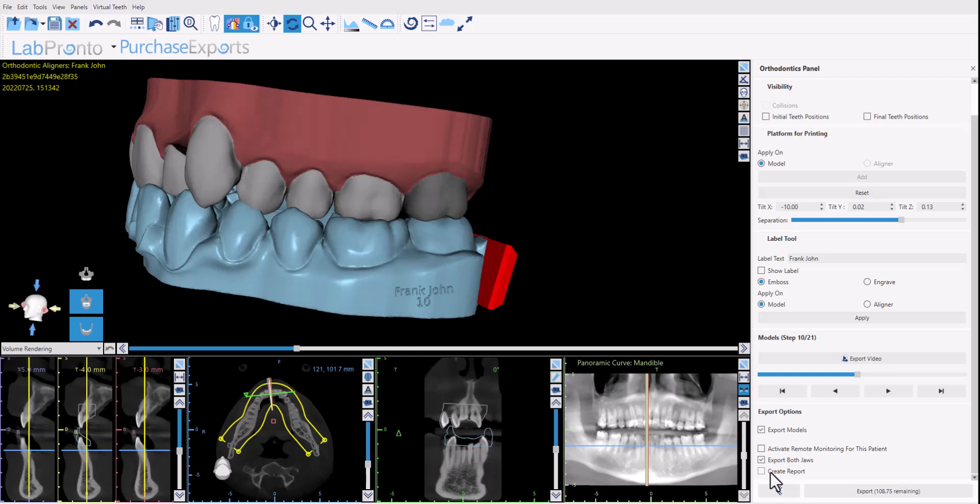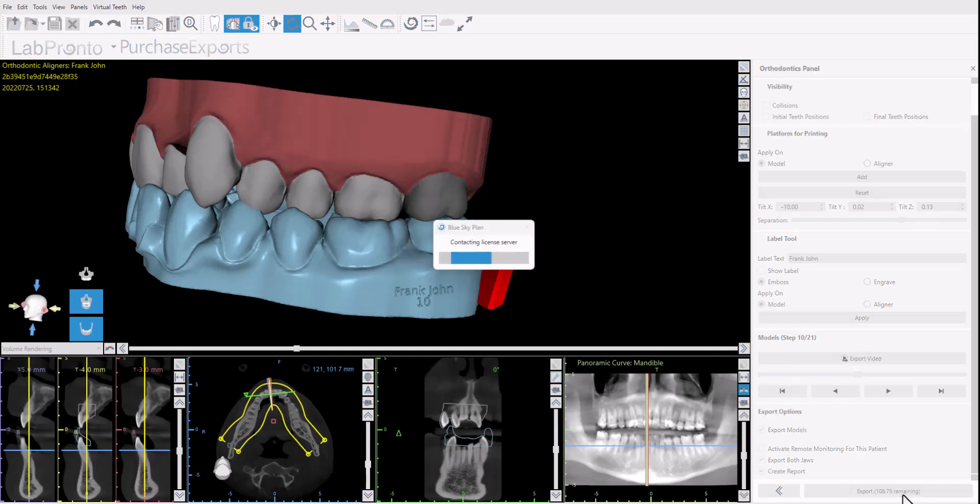If you want to export the models for both jaws at the same time then click export both jaws and if you want to create the treatment report then check the checkbox for create report. Once you have the relevant checkboxes checked, and again we highly recommend the use of the remote monitoring platform which I'll explain in a separate video, go ahead and click the export button.